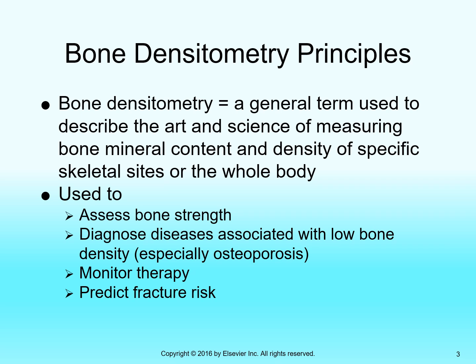Calcium has a high atomic number, so the probability is increased again. So calcium absorbs a lot of a low energy beam. But in a high energy beam, you have more penetration power, and so more of the X-ray gets through.